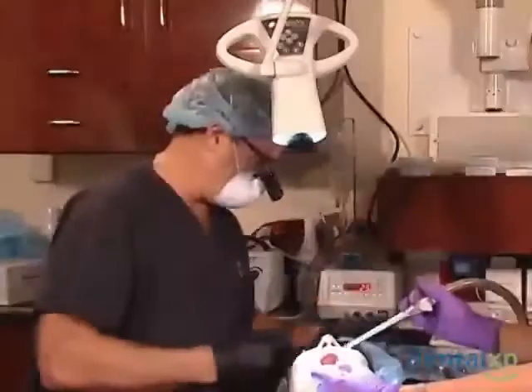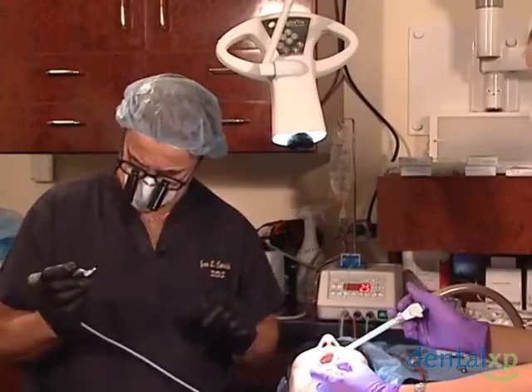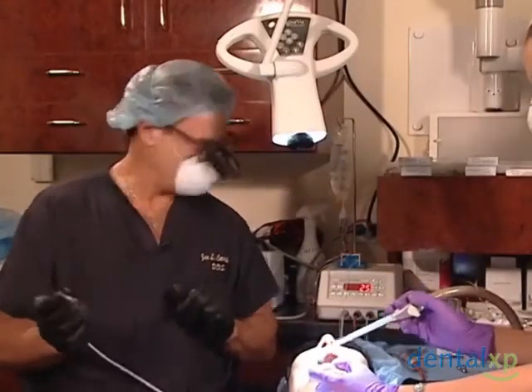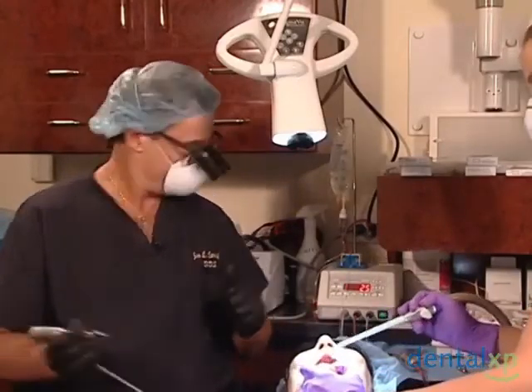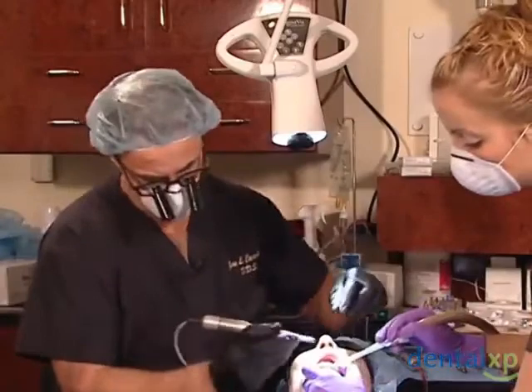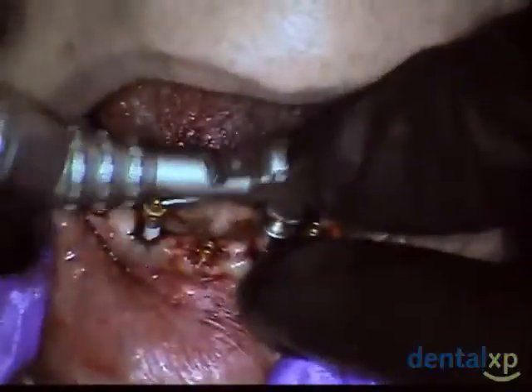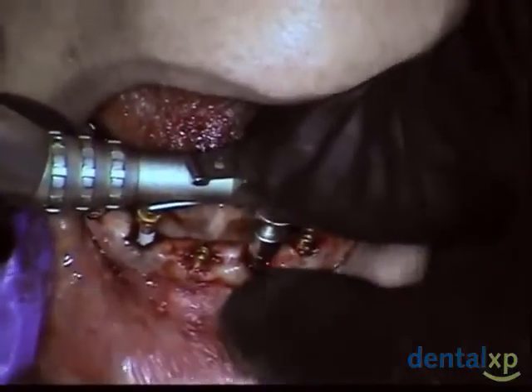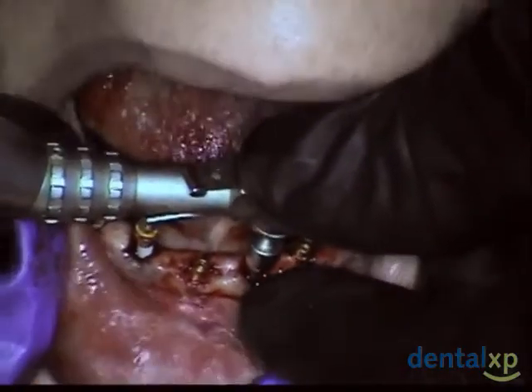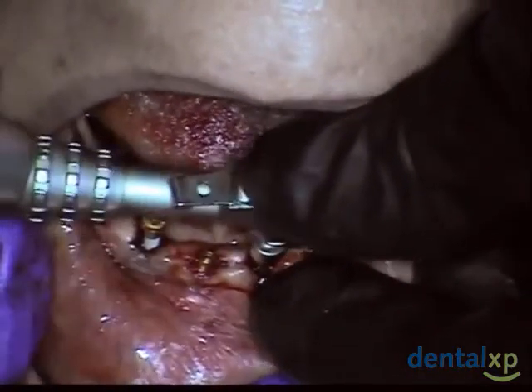Now we're going with our torque limited handpiece, and we're going to drive these to place. I'm just showing you a variation. I could go further with my finger driver, but they seem to be going in fairly easily, so I'm just going to cut down on the time and see if I can't drive these to place a little quicker. Make sure this is seated on the hex. There you go.